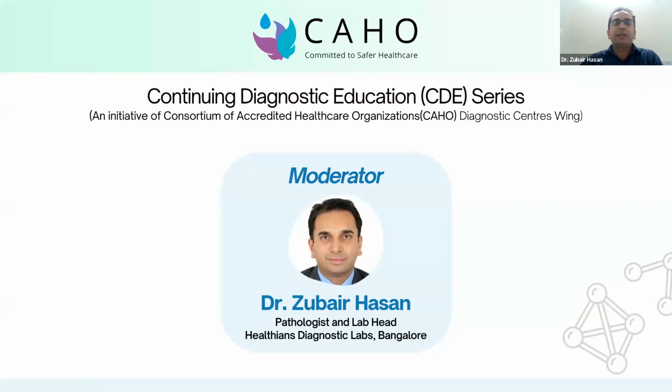So what is IHC? Many times we pathologists sign out reports, and it will be just a small round cell tumor or a malignant neoplasm, query carcinoma, query lymphoma. That is the time we realize that there is something beyond the light microscopy we would like to utilize, and that is the immunohistochemistry.